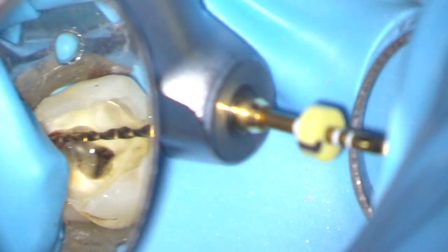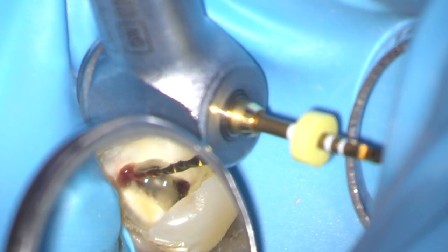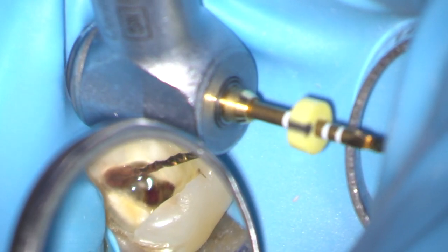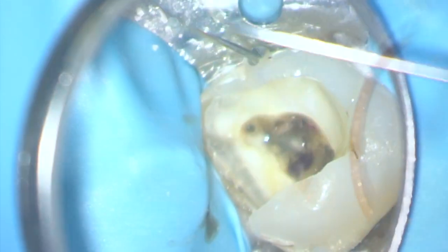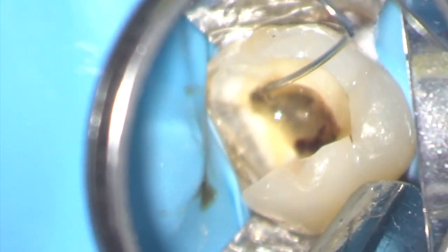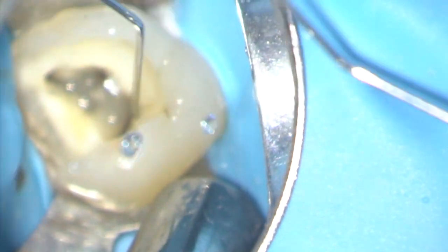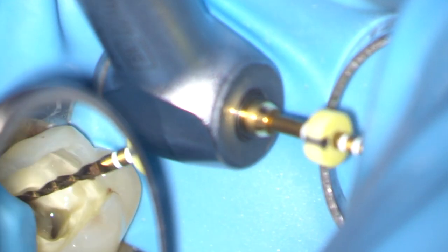Having created a glide path, it's time to taper the root canal. In this case I'm using the smallest Wave One Gold instrument. Here I'm preparing the MB1 canal. It's a sequence of preparation: three steps - irrigation, recapitulation with a size 10 flexor file, and then irrigation back to some more tapering. In each canal it probably takes me two or three stages to reach the full working length.